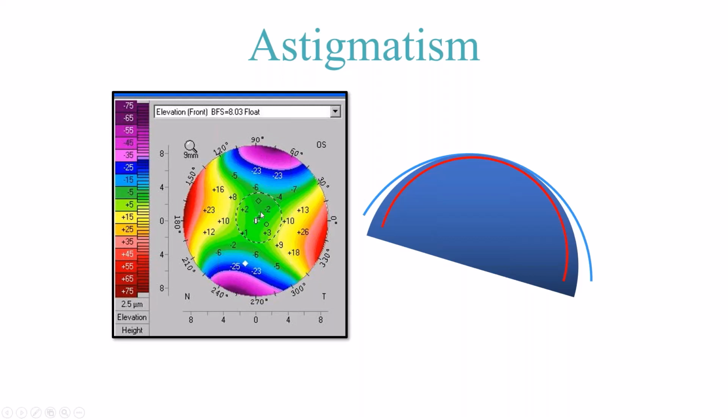So it's very common, I hear people go, well, this has to be abnormal because I see a plus 25 or a minus 25. Well, that can be completely normal in an astigmatic eye as you get towards the periphery.